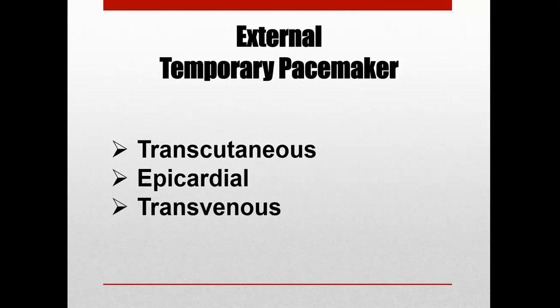When the patient undergoes cardiac surgery, epicardial pacing wires can be placed, and they're usually bipolar leads with two separate wires that are insulated and loosely secured to the epicardium of the chamber that's being paced. Both leads are loosely sewn to that myocardial tissue, so either can be used as the negative pacing electrode.